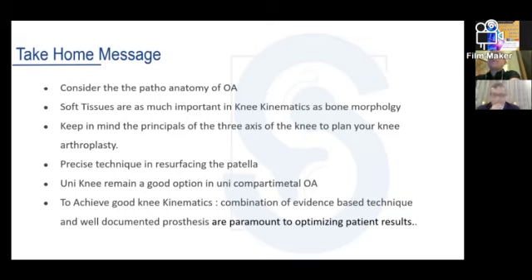You need a minimum of stability. With cruciate retaining, the cruciate ligament, we can do regular total knee arthroplasty. But the peripheral, lateral collateral ligament, posterolateral and posteromedial angles are very important to the stability of the knee, and you cannot correct them only with a regular knee arthroplasty. You have to achieve a more constrained knee arthroplasty.